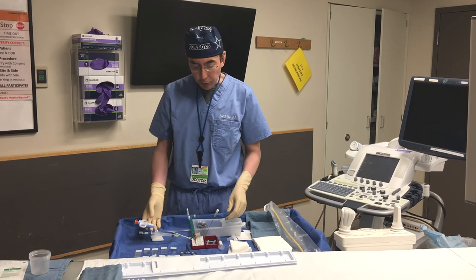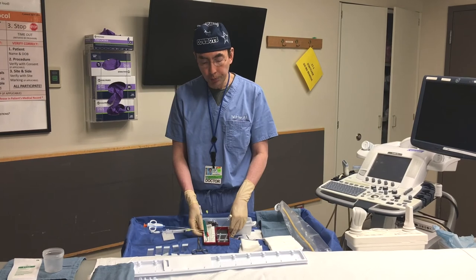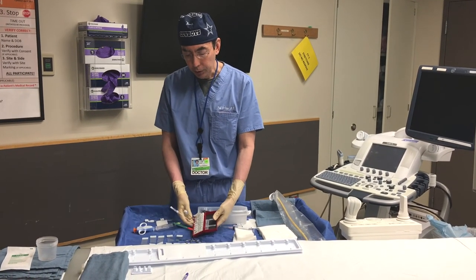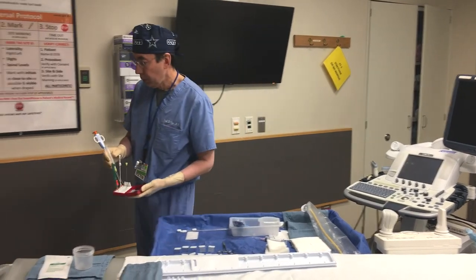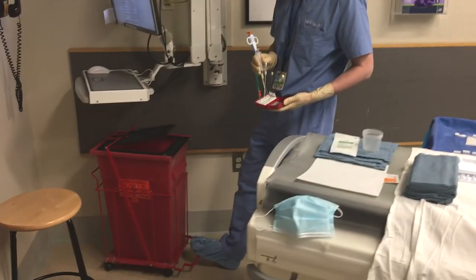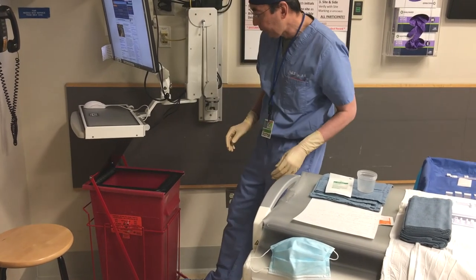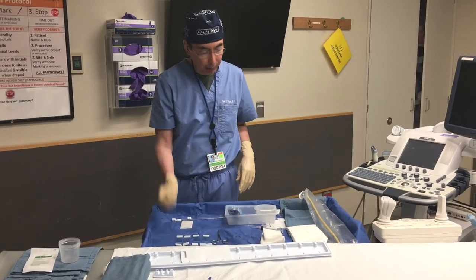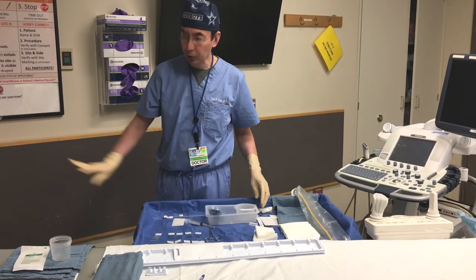At the end of the procedure, you'll have needles, scalpels, and other sharps on your table. It's our job to put those into the sharps container so nobody gets stuck. Use the foot control to open the sharps container and throw off your sharps. Make sure all sharps, including glass slides and needles, go into the sharps container.